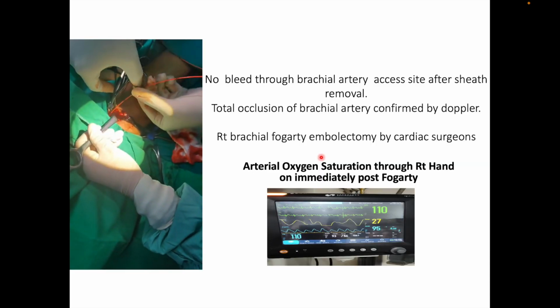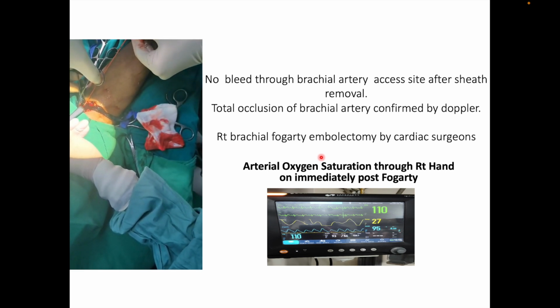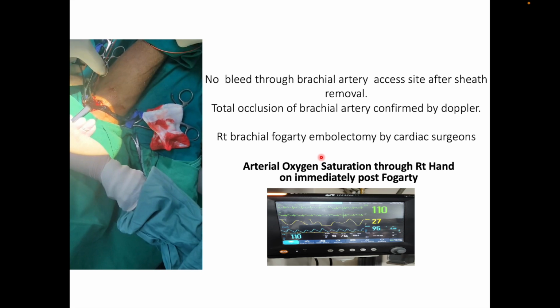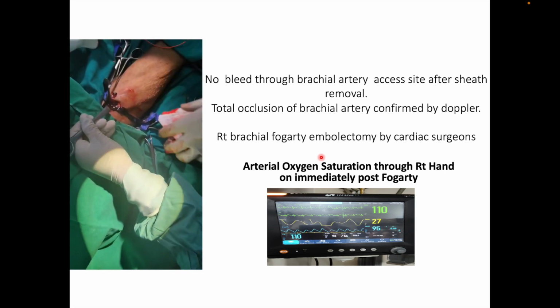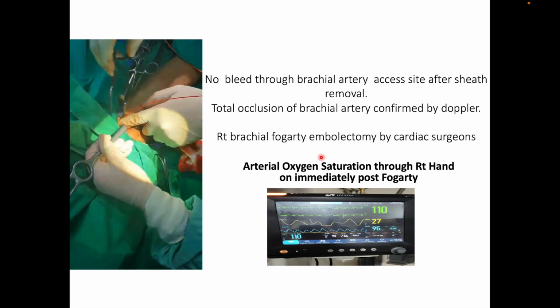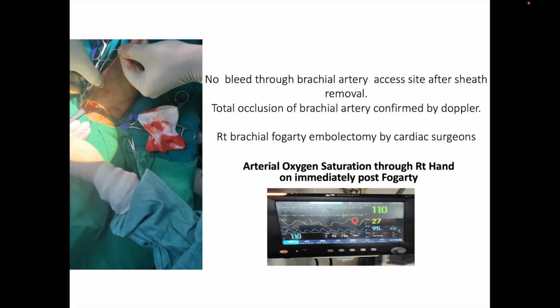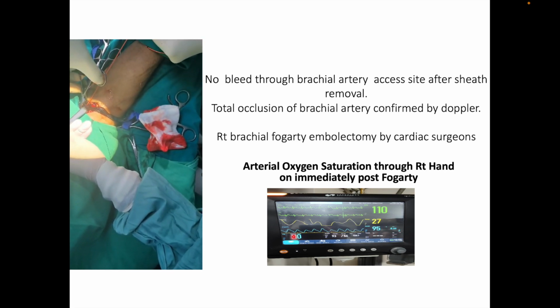And when we removed the brachial sheath, unfortunately, there was no backflow, there was no bleeding from the arm. So we had our cardiac surgeon available who did Fogarty embolectomy, and the clot came out. And that's the saturation of the patient after procedure. You can see here of the same hand, it's 95% saturation.